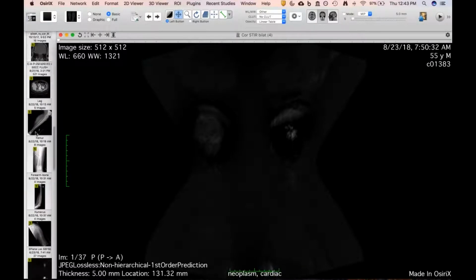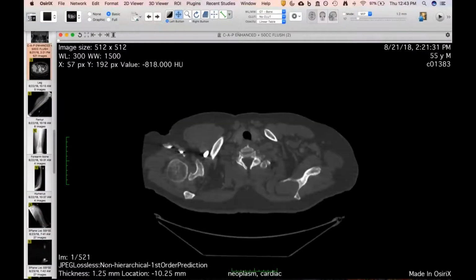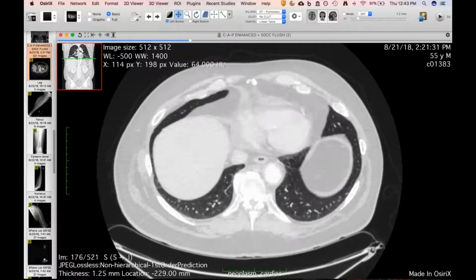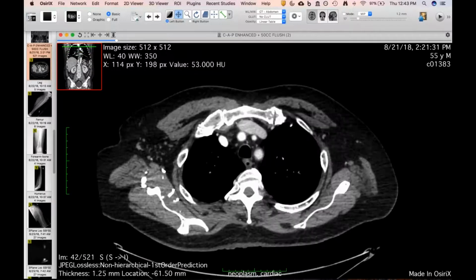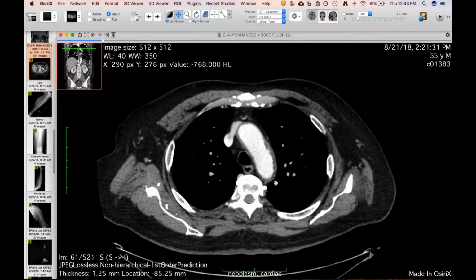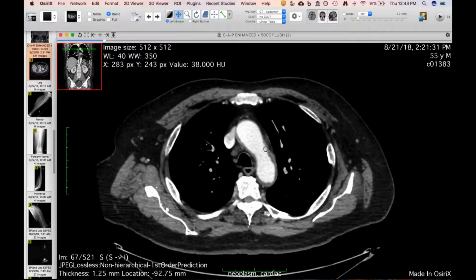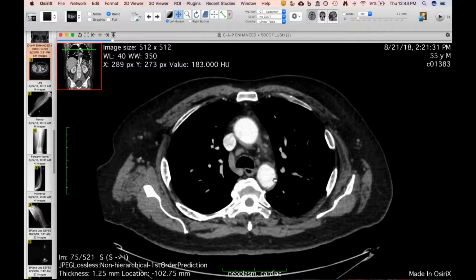No, the lungs didn't really have anything. Actually, that reminds me, there was one other question I had for you. The lungs look fine, but I'm curious what you think of the aortic arch. I think a lot of this is just bad atherosclerotic disease, and there was some question of whether or not there could be a vasculitis. I was like, I think it's just a lot of this just ulcerated plaque.